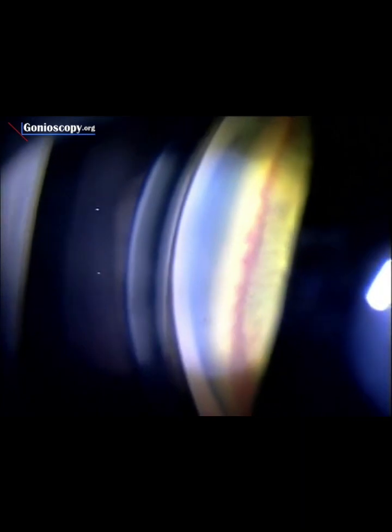On gonioscopy, one can see this lush network of vessels in the angle. Again, this goes 360 degrees. Here inferiorly, we see this hypopyon that is much better than it was a few weeks ago. We can also see synechia that are developing in this area.